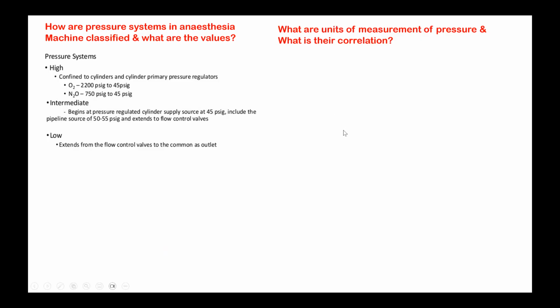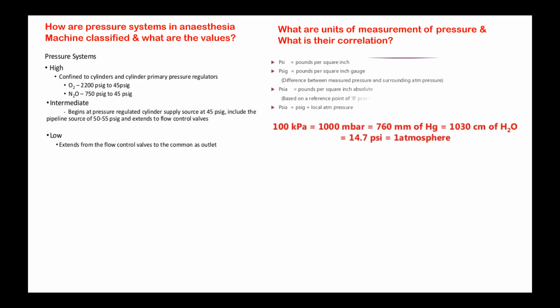So how much is 1 kilopascal in millimeters of mercury? That is the commonest thing that we nowadays come across. In blood pressure, some books say kilopascals, and some books continue to say millimeters of mercury. So if you say 1 kilopascal, how much is that in millimeters of mercury? 7.5 millimeters. Very good. So that is how you remember.